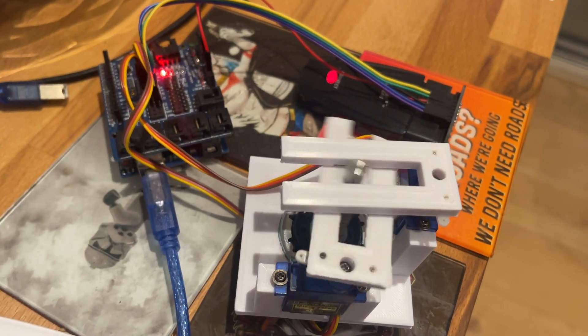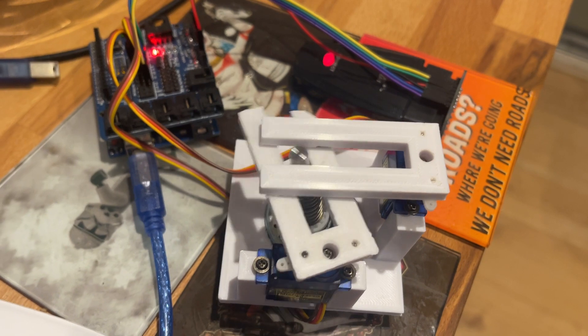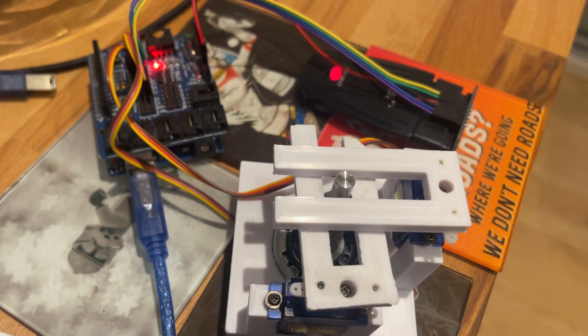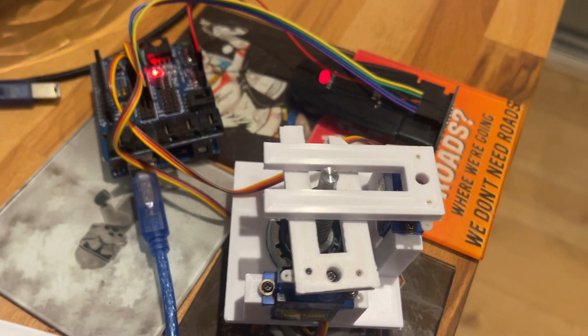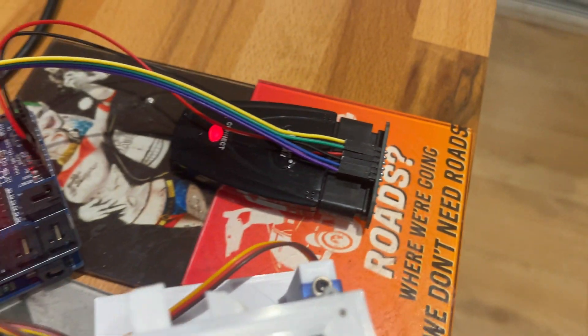This works a lot better than the infrared remote control I had, which had problems with sunlight and all sorts. The wheelchair drove into a wall — it wasn't great. So this works a lot better, and I think this cost me about £8.